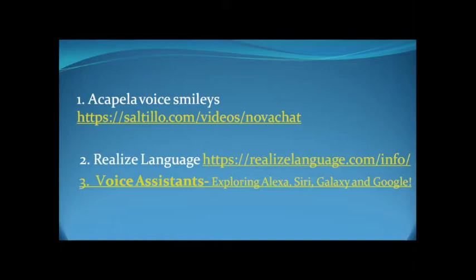Alexa, what is the weather today? So you have a page built in that you can automatically link to? Right. So it's just on the groups page. There's a Hey Siri and then there's an Alexa one. And then this comes pre-loaded. But you can customize it.